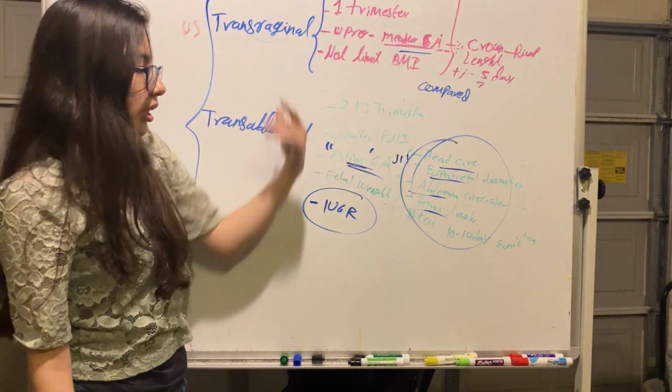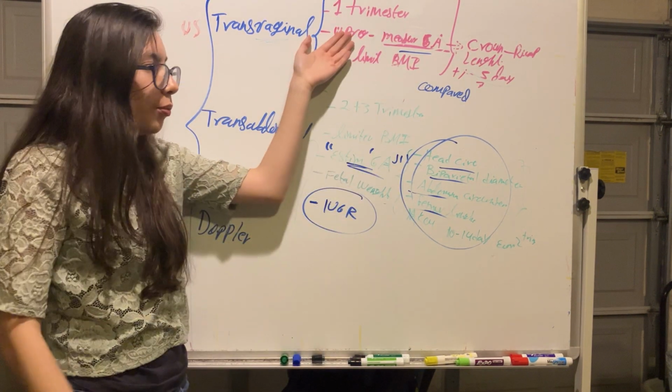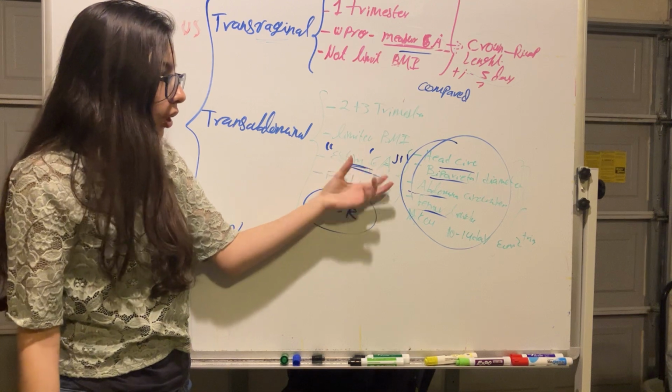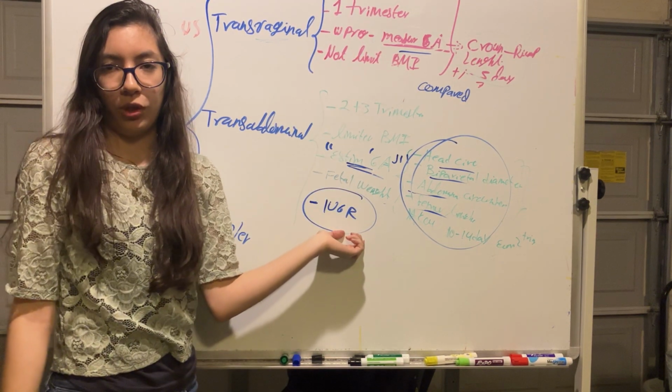But if there is a discrepancy, always the gestational age is the one measured with transvaginal ultrasound. But why do we do a new estimation of gestational age? Because we need to do this comparison to evaluate for intrauterine growth restriction.